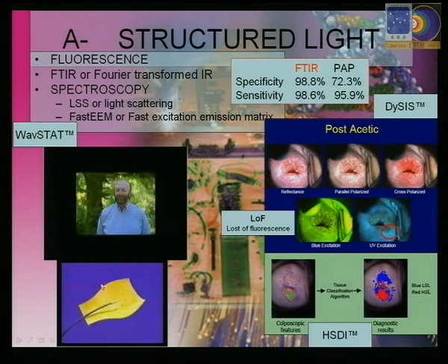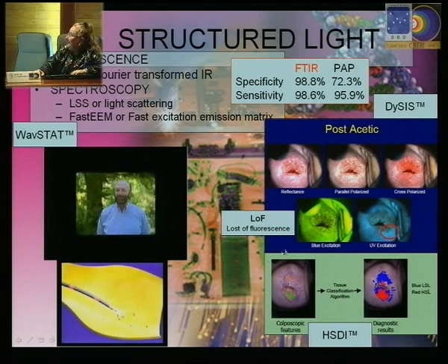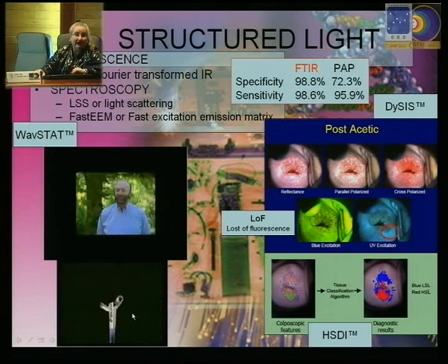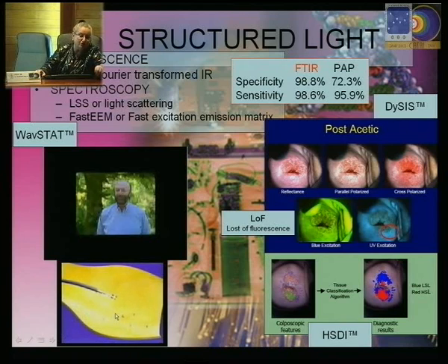The only thing you get here are curves of the concentration of substances which are in the area, and those curves are interpreted as benign or malignant according to a training set that had been done in this system. This means that you do a colonoscopy, and immediately you detect if that polyp or any area is suspicious or not. You take the suspicious ones and you can leave the rest of the items which are not so suspicious.